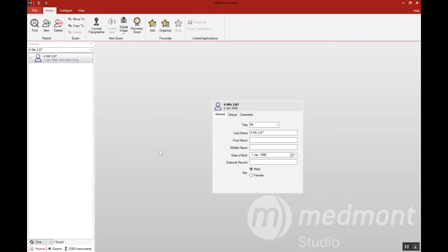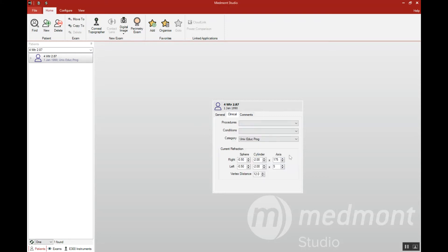This video reviews the construction of a corneal GP toric lens in your Medmont contact lens software. First, begin by ensuring that you've entered the patient Rx. When you click on the patient name, then go to the clinical tab and enter the Rx here.